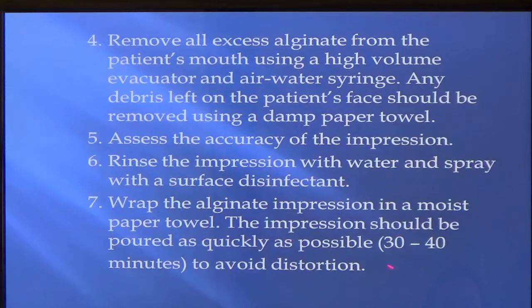Here it says 30 to 40 minutes. You want to pour it up within an hour usually, which is good. And when you put it in a towel, the towel should be damp. It shouldn't be dripping water. So wet a towel, squeeze it, and then wrap the impression.